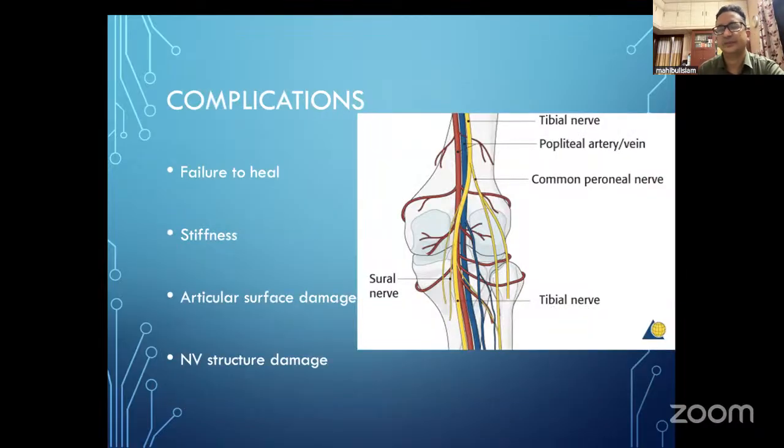The complications of meniscus repair include neurovascular injury, especially to the saphenous or peroneal nerve, infection, joint stiffness, and re-tear or failure of healing. Other risks involve synovitis, chondral damage from implant or suture, and implant migration or breakage in all-inside devices. Proper technique reduces this risk significantly.